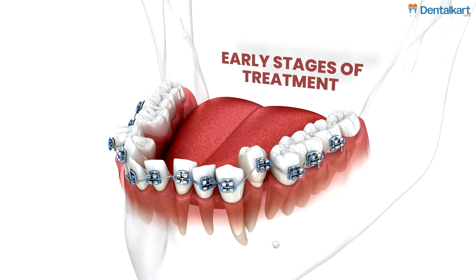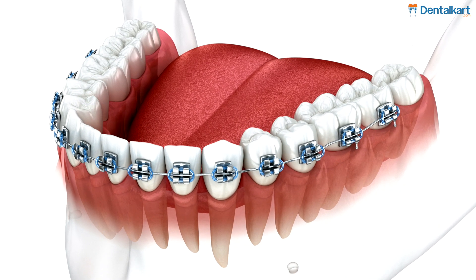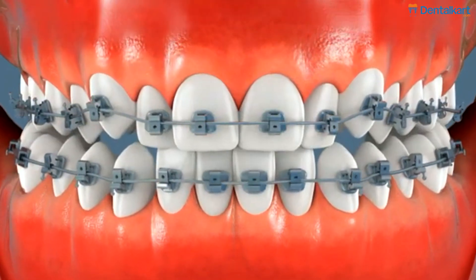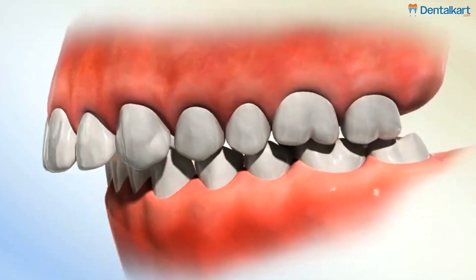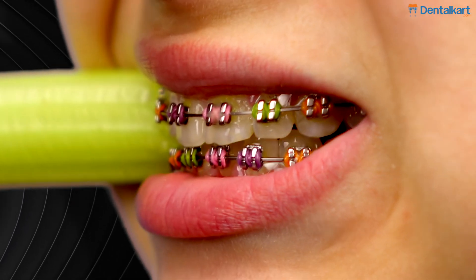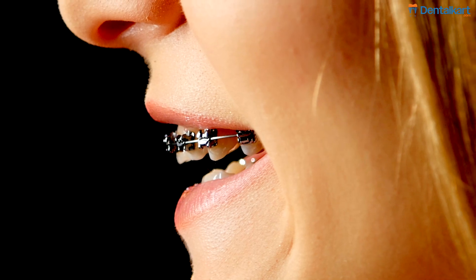Early stages of treatment: NiTi arch wires are ideal for the initial phases of orthodontic treatment when broad, gentle tooth movement is needed. Crowding and alignment: their flexibility and shape memory make them excellent for aligning crowded teeth. Malocclusion correction: they are highly effective for early stage corrections where only minimal force is needed. Minimal patient discomfort: NiTi wires maintain continuous light pressure over an extended period, making them suitable for sensitive cases where comfort is a priority.